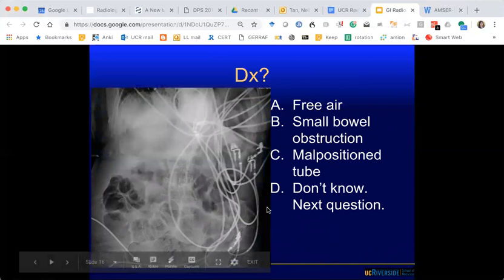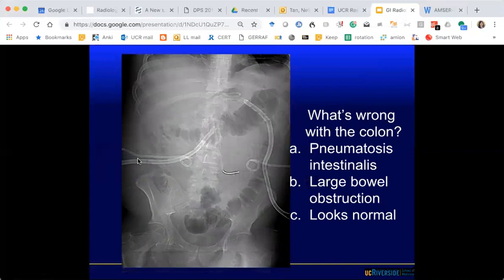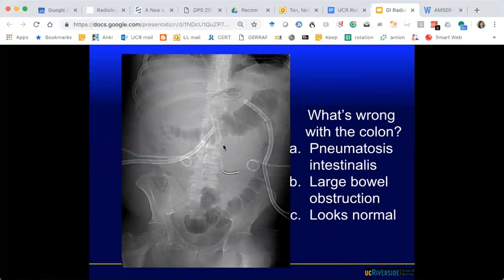What's wrong with the colon? This is the colon here — the air-distended colon — and I want you to focus on the right colon. Guesses include pneumatosis, large bowel obstruction, or normal. The patient has a lot of catheters and tubes and has a history of necrotizing pancreatitis from binging on alcohol after Coachella. The consensus is that it's normal — these are just catheters draining the necrotic bed of the pancreas.